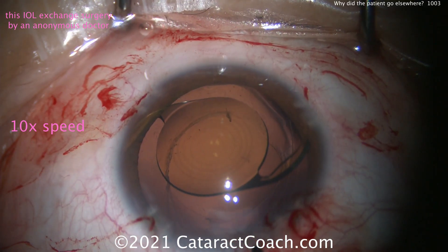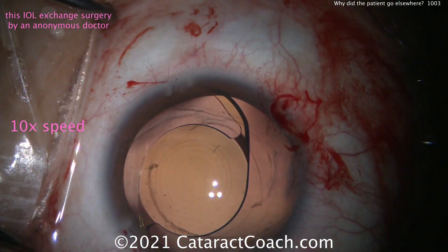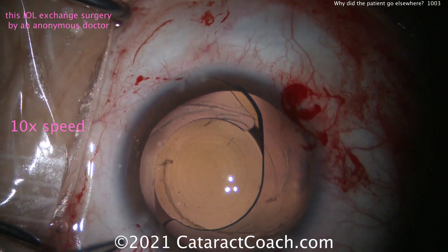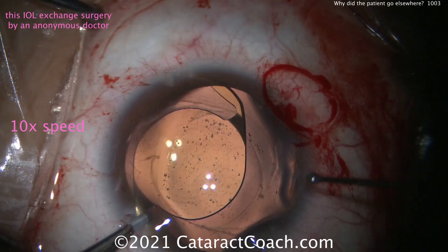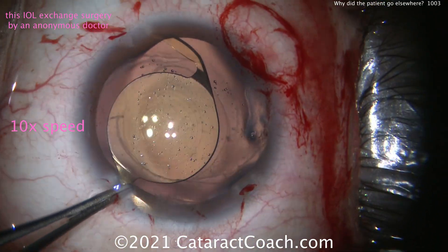There's the IOL. Good job dissecting it out of the capsule bag. This surgeon doesn't really open my main incision and has a hard time with that, so he's going to create a separate incision. My main incision sealed up beautifully because, as I've taught, I nicked those limbal vessels. My advice though: next time you want to open it, use something a little sharper like a Sinsky hook.